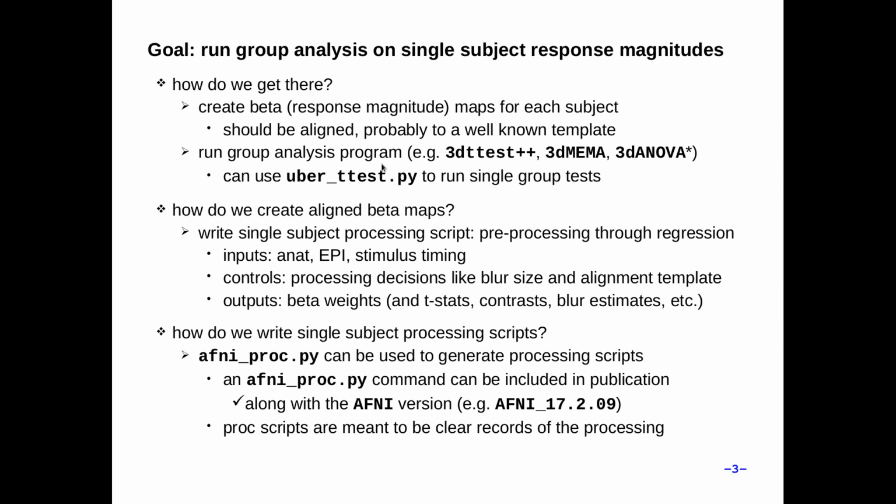If there is an atlas you like a lot, but the template that is aligned with that atlas is not in a space that you care about, you might be able to contact us to see how you might get that into a different space. But that's beyond this course right now.